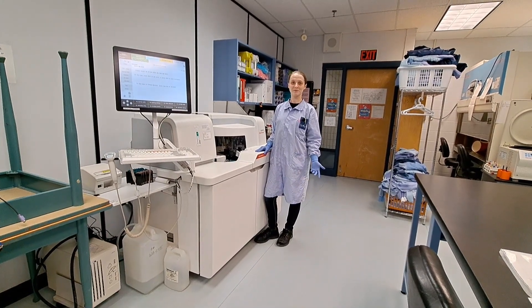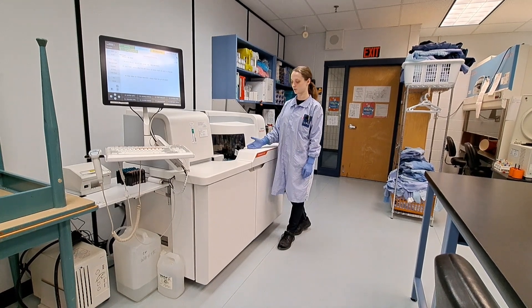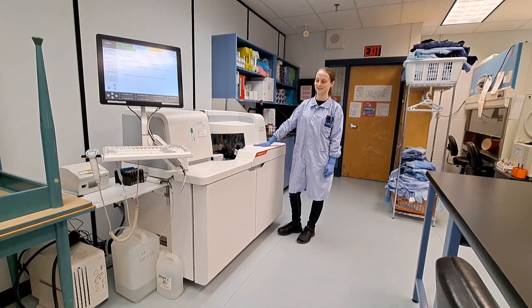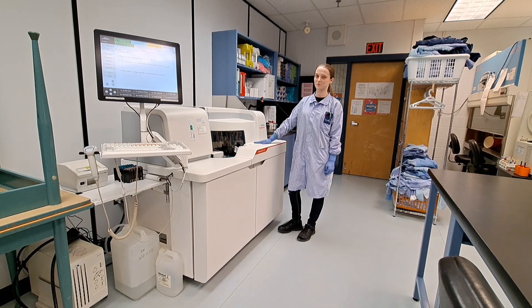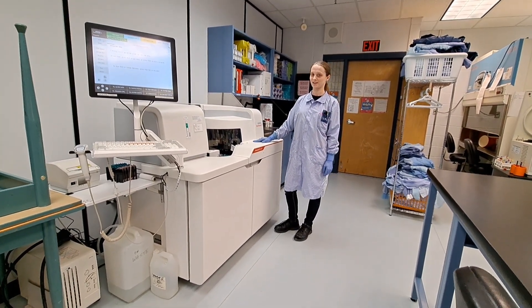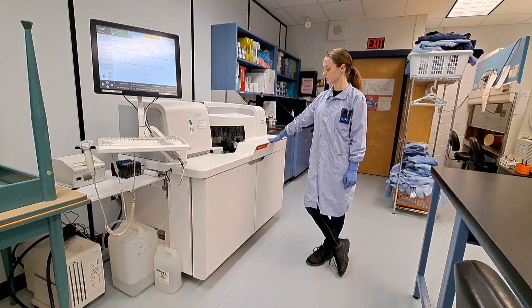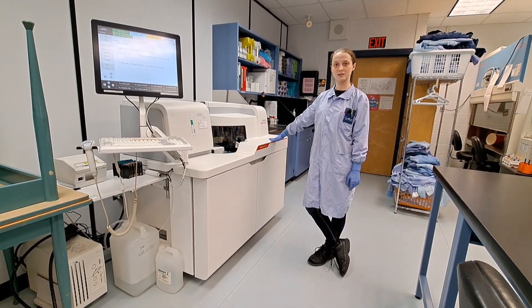Hello and welcome back to the lab. My name is Liza and I'll be navigating you through our Siemens Dimension EXL-200 — far too many words, so from here on out we'll refer to it as either the Dimension or EXL. I'll quickly navigate you throughout this analyzer and then I'll show you how to do some QC and patient testing.